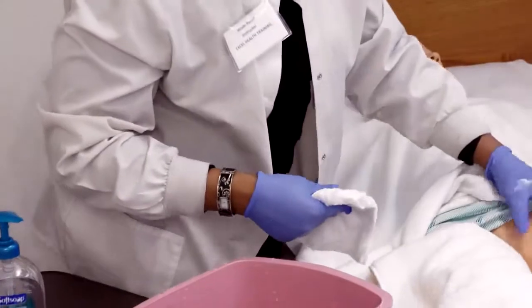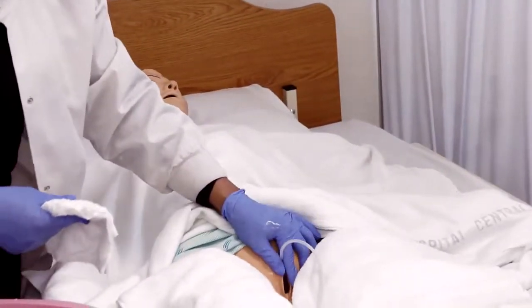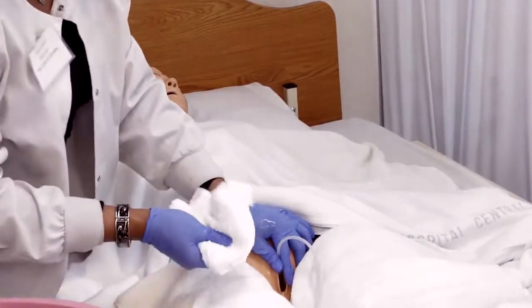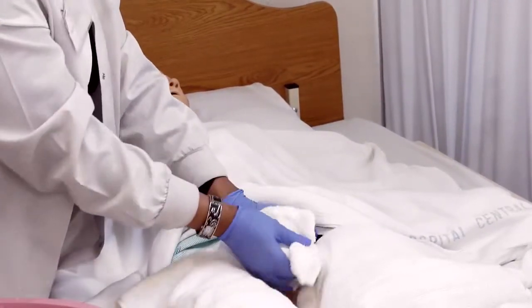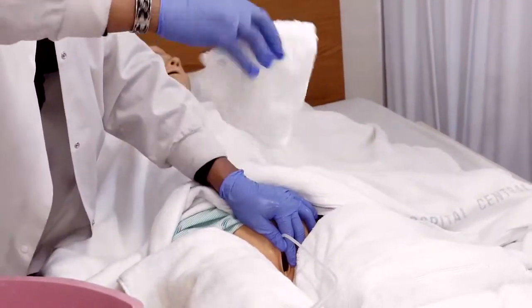Then you want to grab at the meatus. Very important. You don't want to grab the catheter tubing. Place your hand firmly against the meatus so it protects the catheter. So we want to wash down 4 inches. And then we get a clean section.